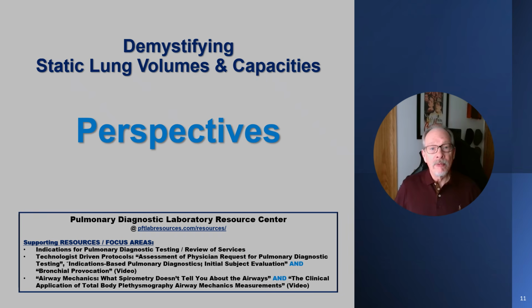As with any test for static lung volume, certain limits exist. It's incumbent upon the technologist administering the test, as well as the physician interpreting the test results, to realize and appreciate how the data are derived and reported. Some limitations associated with VTG include, but are not limited to, the following possibilities. Overestimation of VTG in subjects with moderate or severe obstruction, which is minimized with appropriate panting frequency. Erroneous measurement of VTG owing to improper panting technique.